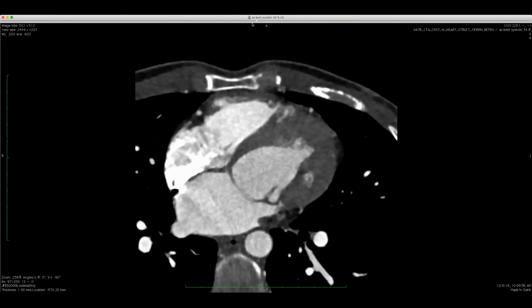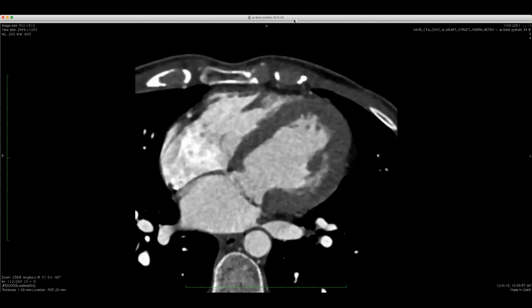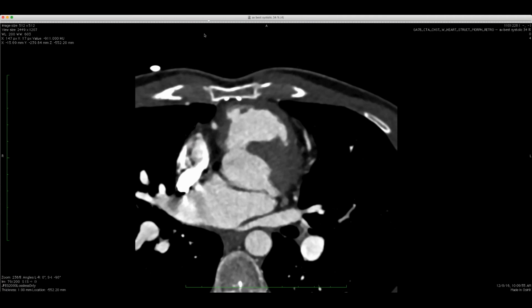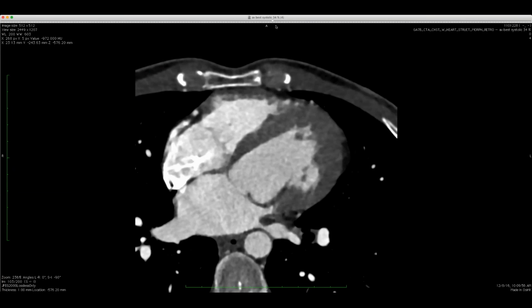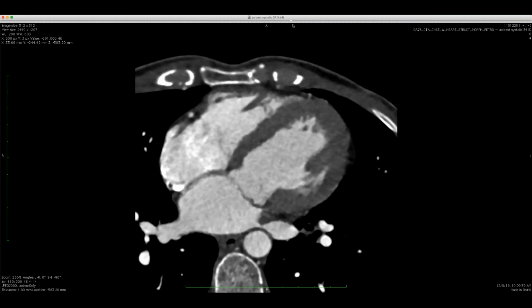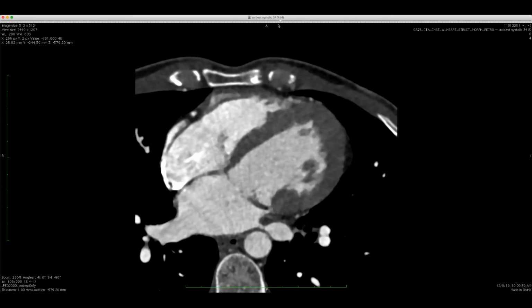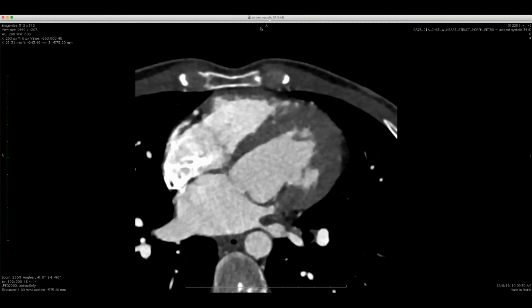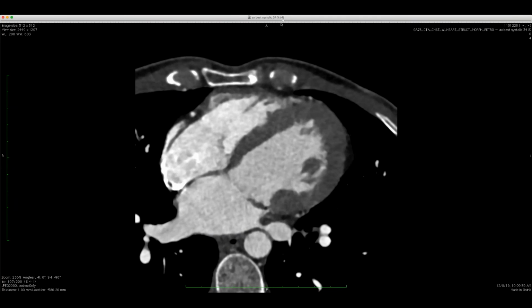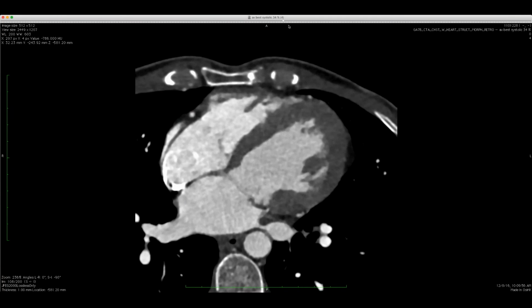Wow. Have other people seen that? I thought you were going to show me a case of sarcoid pinching off the pulmonary veins, and I showed one a few weeks ago, and I was hoping other people would come up with their sarcoid-induced pulmonary vein. But there's no tissue surrounding this. Sorry, I'm going to bring that case. I forgot to do this week, but I'll bring it. You promise? Yes, I do promise. Then it's an email reminder, David, because I think I might have one too, but I forgot to look for mine. Okay. But I thought that was interesting.